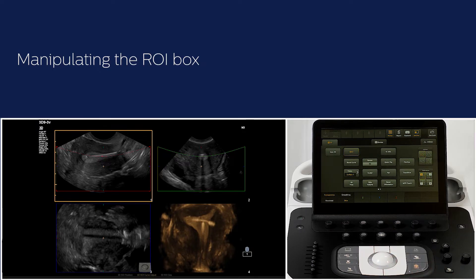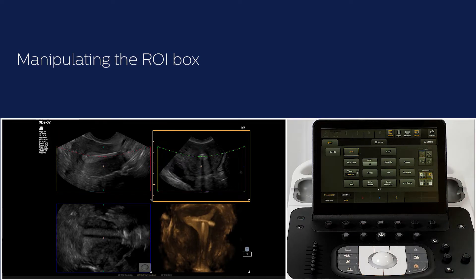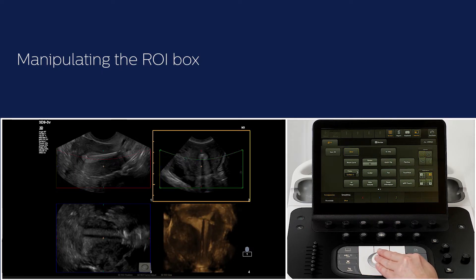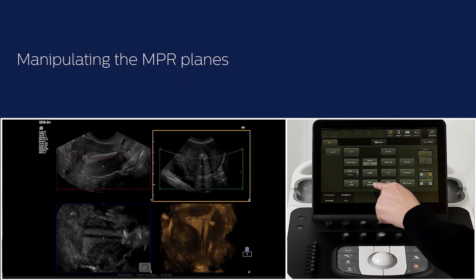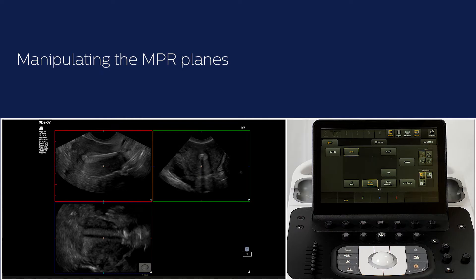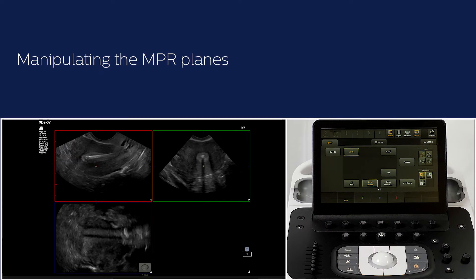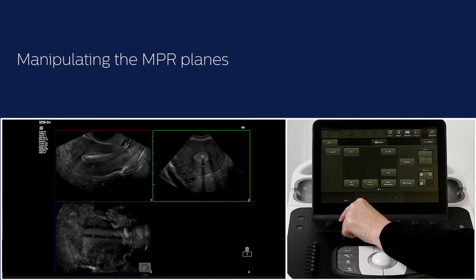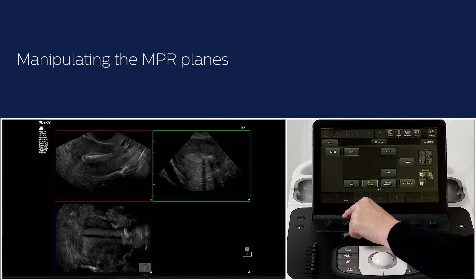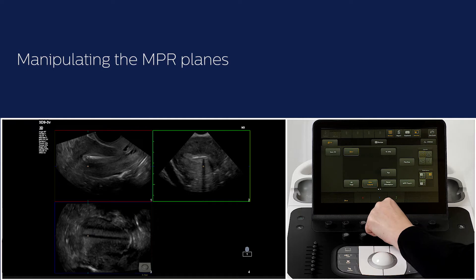For example, if I want to change the ROI size on the transverse plane, I will select the transverse plane number 2 on the touch screen. Use the buttons next to the trackball, select 3D ROI Size and move the trackball up and down or left and right to change the box size. Let's take a look at how we can manipulate the MPR plane. You can slice through a specific plane by selecting the plane on the touch screen and turning the slice knob, or turn the X, Y and Z knobs to rotate a specific plane.